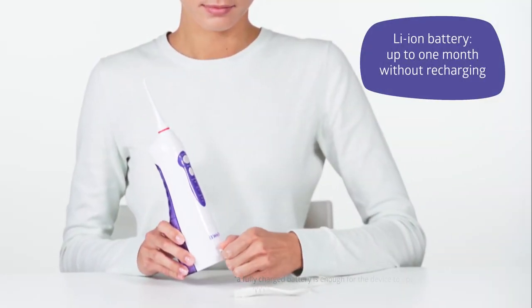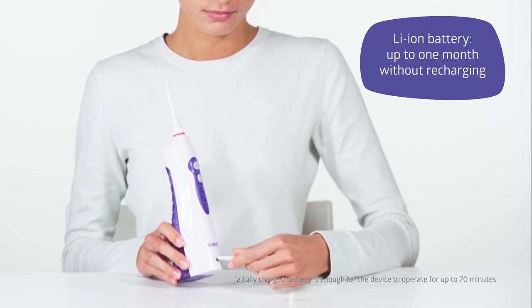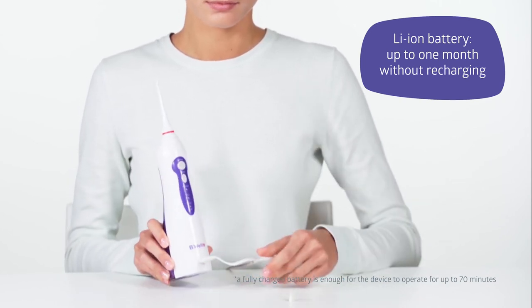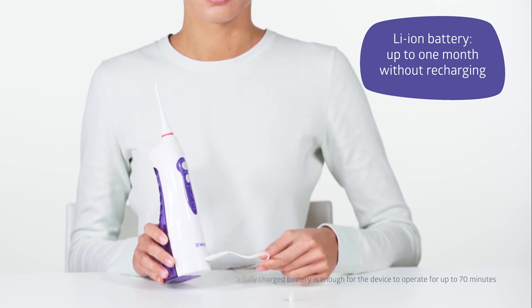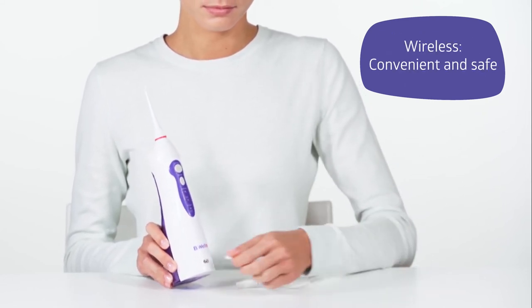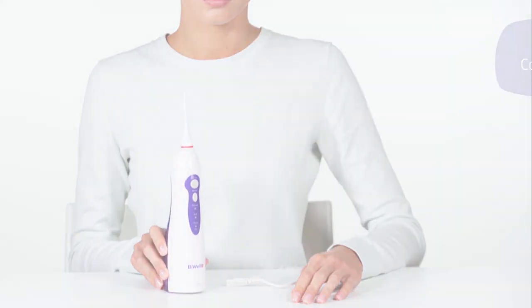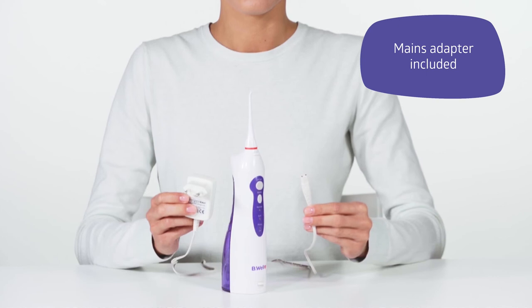Remember about the battery charge. The Be Well Irrigator uses a modern, safe, and convenient lithium-ion battery. You will not be bothered by wires and will not require a socket in your bathroom. A fully charged battery will be enough for the device to operate for a month. Comes with a mains adapter.